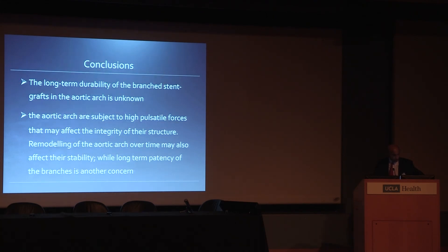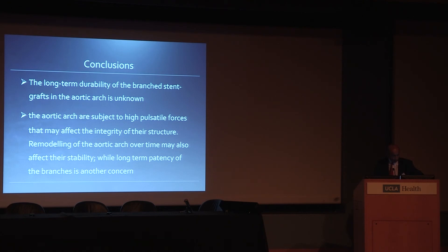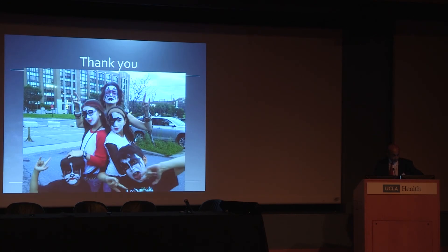The one thing we don't know is long-term durability — I think we will know in the next five to ten years. I'm hopeful we'll get a trial in the United States, based on the fact that many of these patients are not as custom-made as we think with the branches — it's really just the proximal diameter that's different. So perhaps it's not in the distant future that we'll have this available.